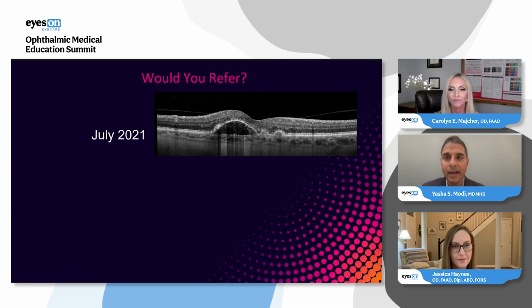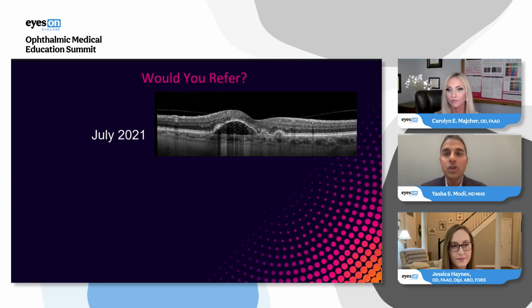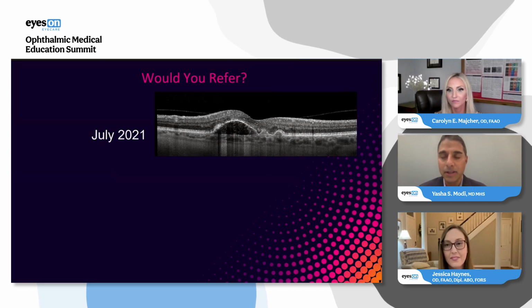While we get those polling responses, we do have a couple of questions that we can get to in the meantime that some of you have posted in the chat. So I'm going to ask actually Dr. Haynes, do you measure the choroid with the calipers as a standard thing? That was one of the questions.